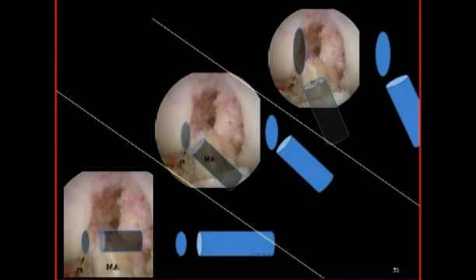The vertical height of the drill holes increases as the angle of approach of the drill bit diverges from the horizontal. This is not directly related to malposition of the femoral drill hole, but it should be evident that, if the surgeon drills into a bone surface that is horizontal, he is drilling into the roof of the intercondylar notch, where no fibers of the ACL have their attachment. Also evident is the fact that a round hole cannot be drilled in the medial wall of the condyle if the drill approaches the femur through a drill hole in the tibia.